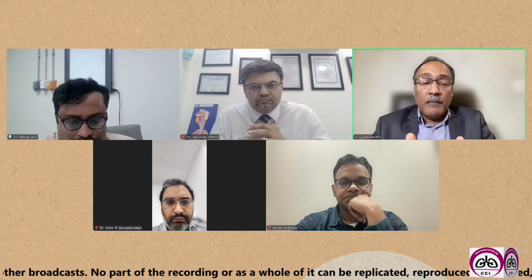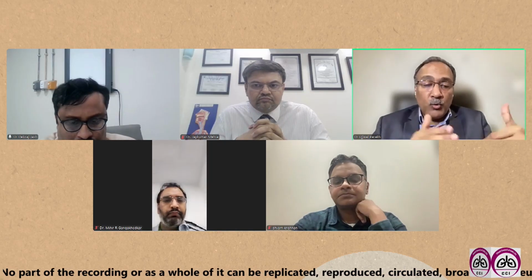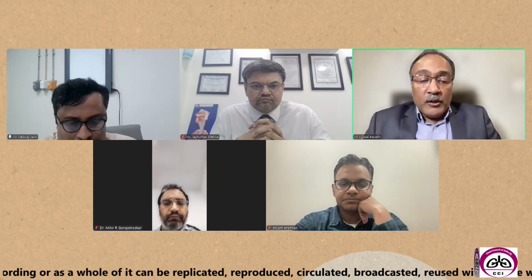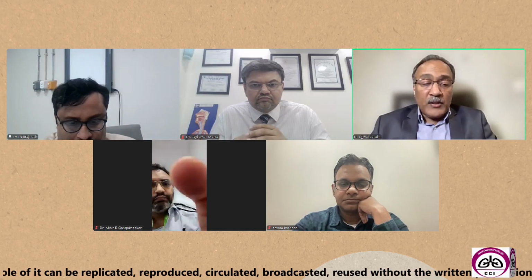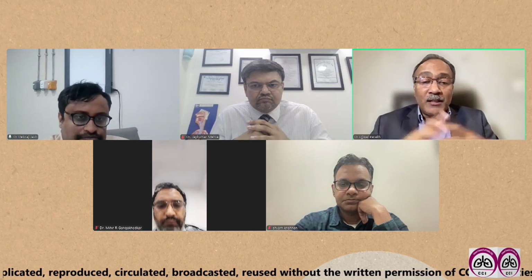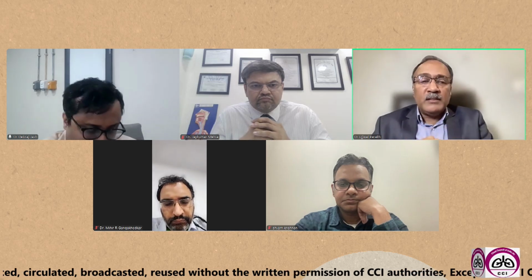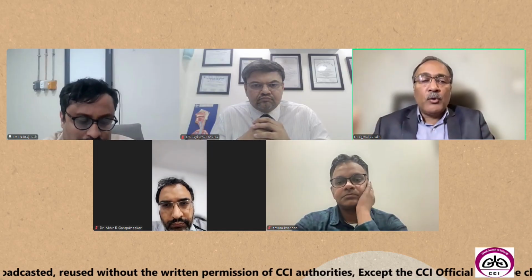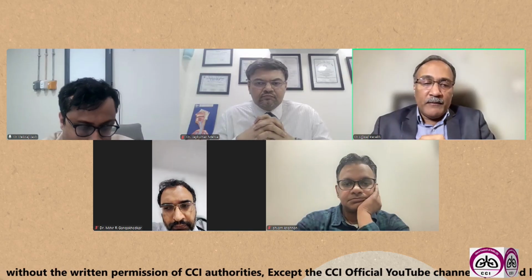Your requirement is a calmer patient who is not moving too much, and their requirement is that you are not doing a procedure where they have to give too many medications, or too deep a sedation, especially in patients with COPD, so much sedation that the respiratory rate goes down. That can increase the CO2 levels. So these are certain things that need to be kept in mind. But as you keep on doing the procedures, you keep on growing, and then you can prevent all these kinds of complications very well.